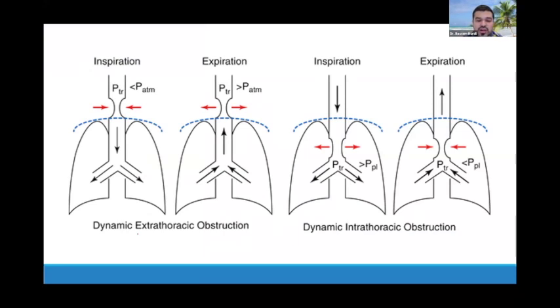Okay. Now, for this part, we talked about all these other things. We talked about lower airway disease, the process of thinking about obstruction versus restriction. But now, some of the other data that would be really helpful to know from flow volume loops is actually upper airway obstruction.